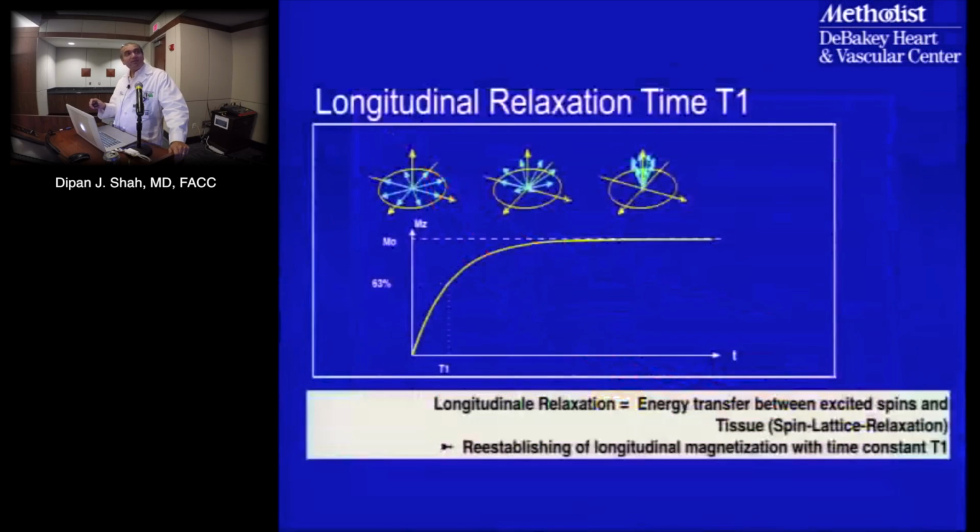And then you've got the second phenomenon happening at the same time. One is you have a decay in the XY plane. You also have a regrowth in the Z direction, or the longitudinal direction, because once you stop applying that radio frequency wave, the tendency is to go back to the resting state, and the resting state again is in the upright or longitudinal plane.